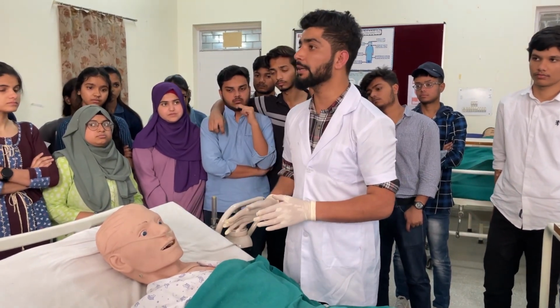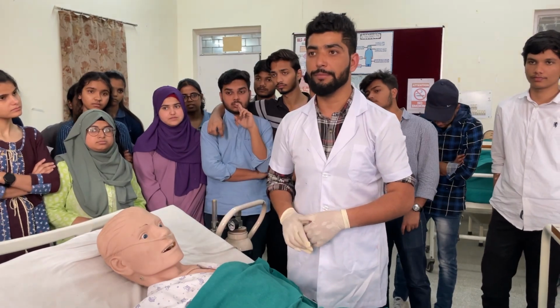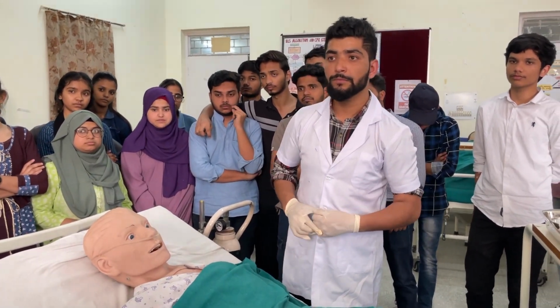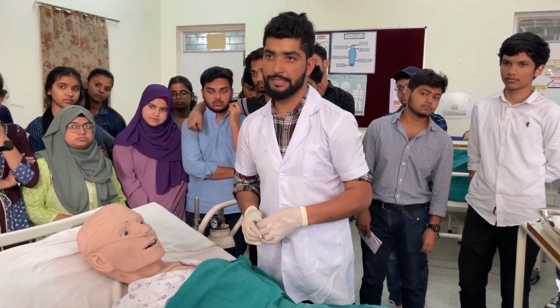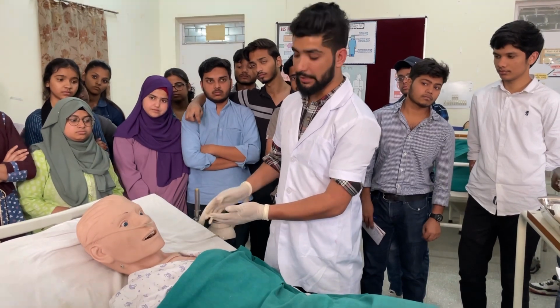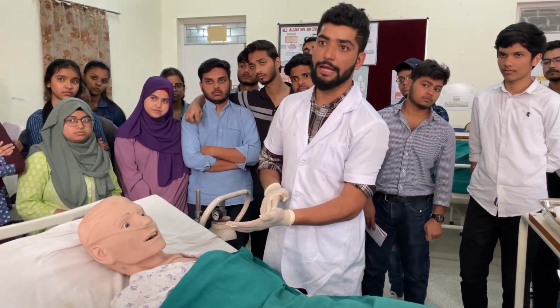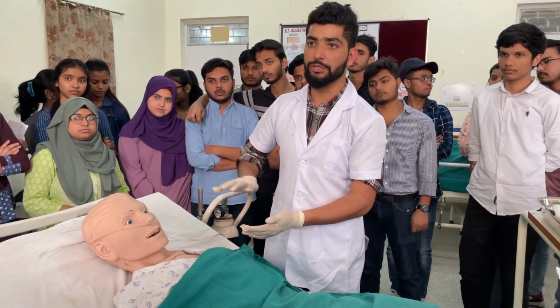So this was the nasal cannula. After putting the prong, you will start the regulator. How will you know that oxygen is flowing? Ma'am, we have to check this on the hand. After that, we have to put the nasal prongs into the nostrils. You have to explain that also, no?